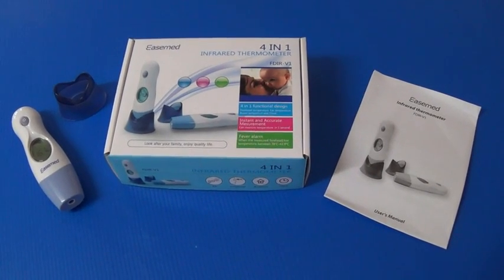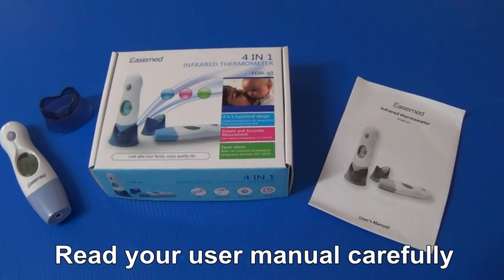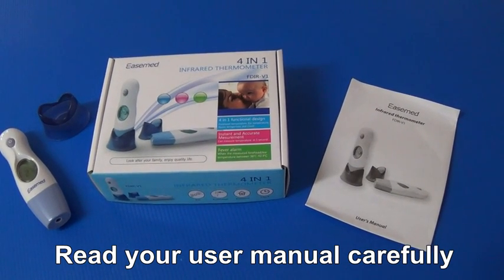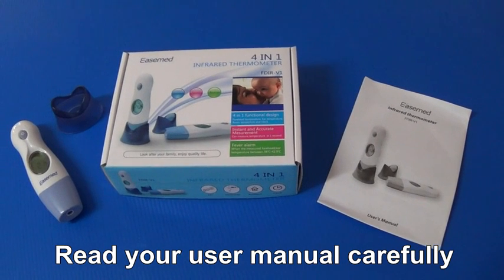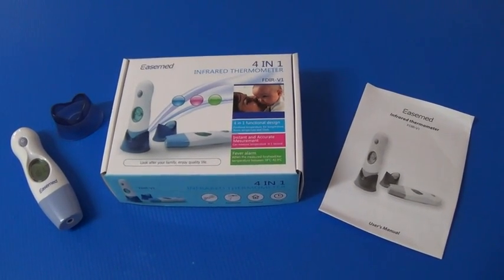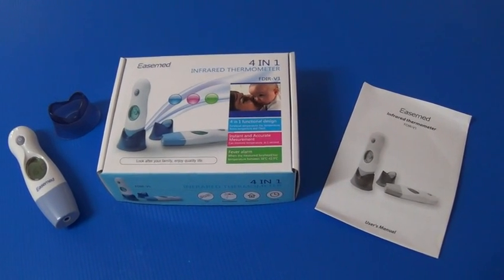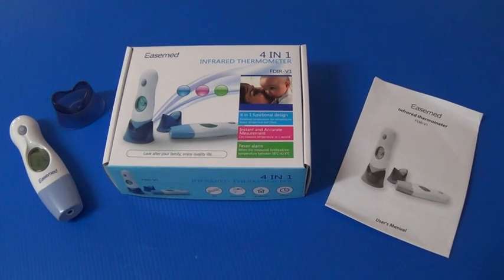In order to properly use this product I do stress that you read the full text of the instruction manual before using, in particular the safety precautions section. Please keep the instructions on the side for easy checking while you're taking the temperatures, and also keep the manual safely in case you need to refer to it at a later date.